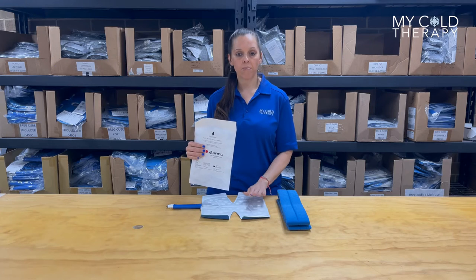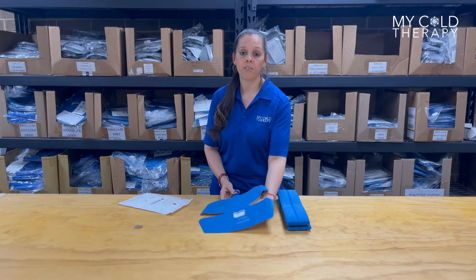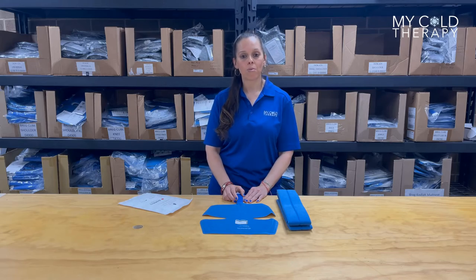Just make sure you put something in between the pad and your skin. For full specs on the Hip Pad, just visit our site, www.mycoldtherapy.com, and now we're going to apply the pad.